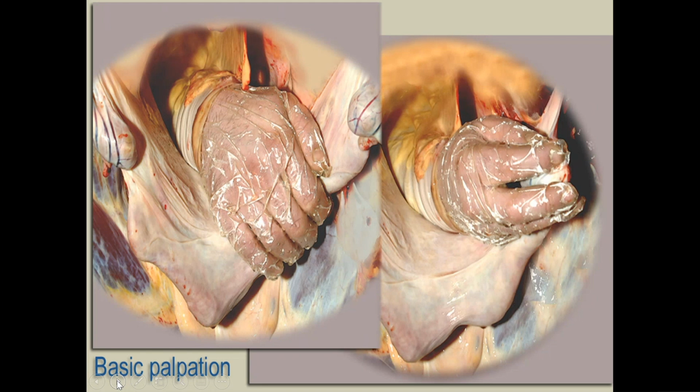But it may not be lying like that in the mare. It may be moved around if she's got full intestines or a full bladder. So the initial rectal palpation serves to lay the reproductive tract out such that when we go back in with the ultrasound transducer, we're going to have all the structures in the right place, and this will facilitate our interpretation of the ultrasound image.